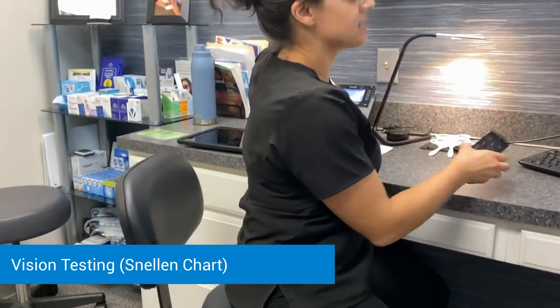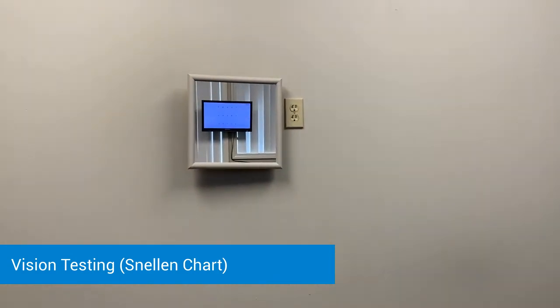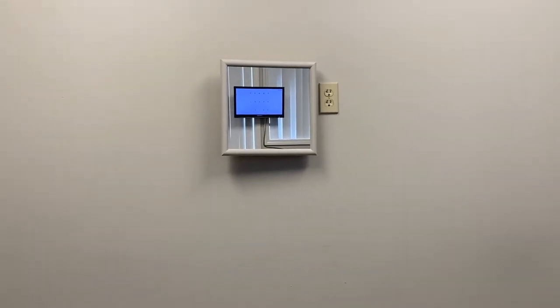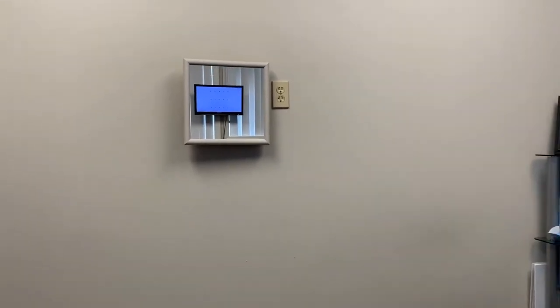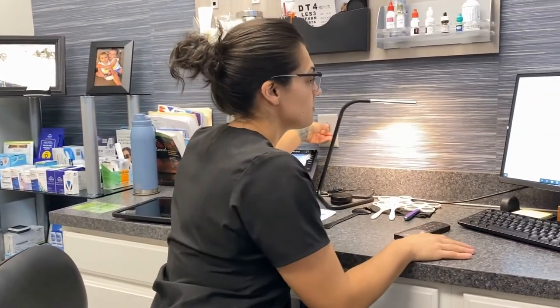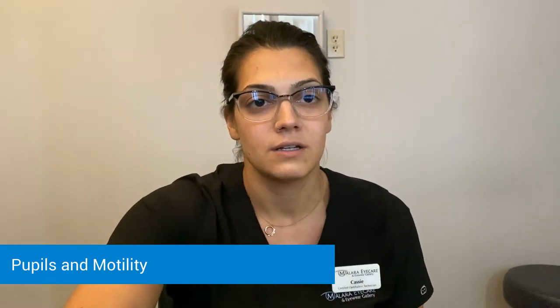Then we're going to go into checking distance vision. I'm going to hand you the occluder — have you cover up your left eye first. You're going to tell me the lowest line you can see up on that screen. Then we'll cover up the other eye and do the same thing. Last, we're going to check pupils and motility, just to make sure the eyes are working well together as well as responding. Just look straight ahead towards my nose — going to shine a quick little light. Next, you're just going to follow my finger with just your eyes, try to keep your head nice and steady.